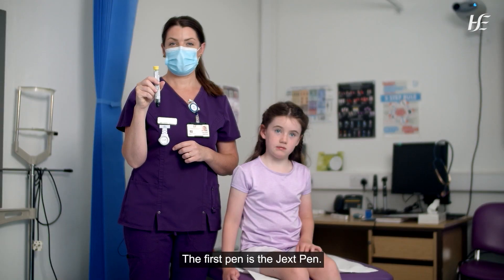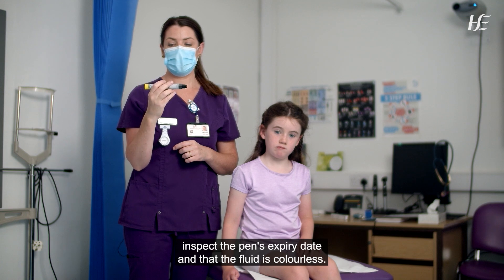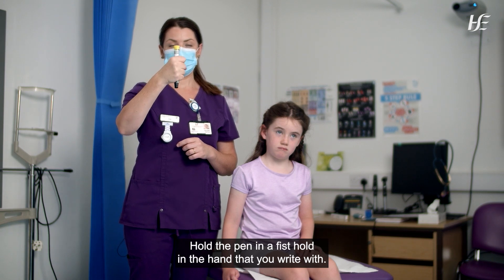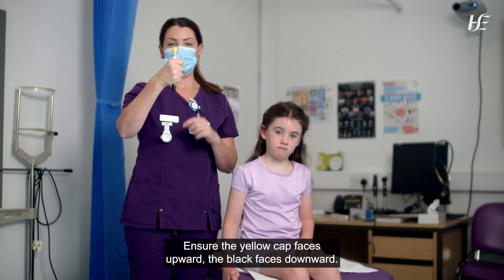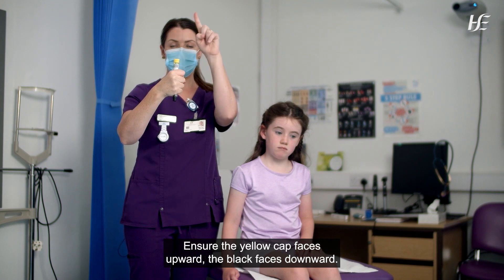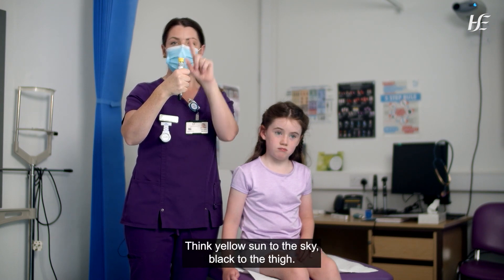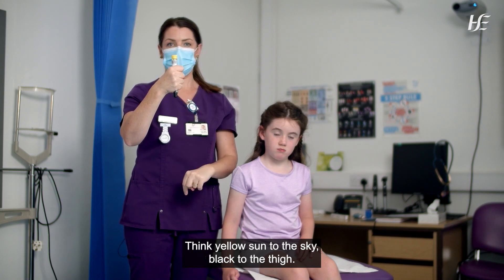The first pen is the Jext pen. Inspect the pen's expiry date and ensure the fluid is colourless. Hold the pen in a fist hold in the hand that you write with. Ensure the yellow cap faces upward and the black faces downward. Think: yellow sun to the sky, black to the thigh.